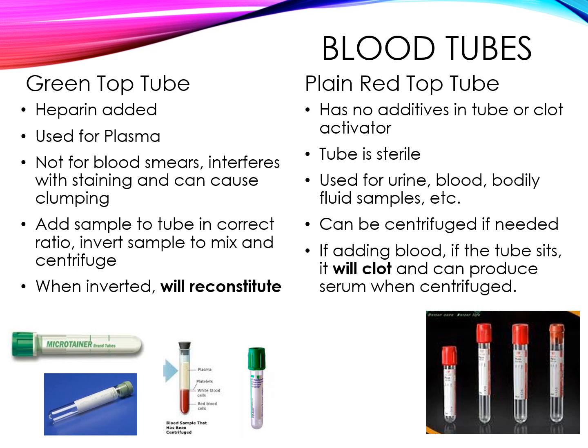And this is another tube where you want to make sure that you put in the correct amount of blood so that the anticoagulant mixes with the blood in the proper ratio. The plain red top tube is another tube that we use for certain chemistries. For example, it's used for digoxin levels commonly.